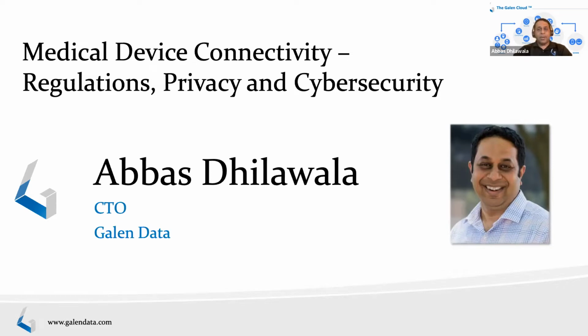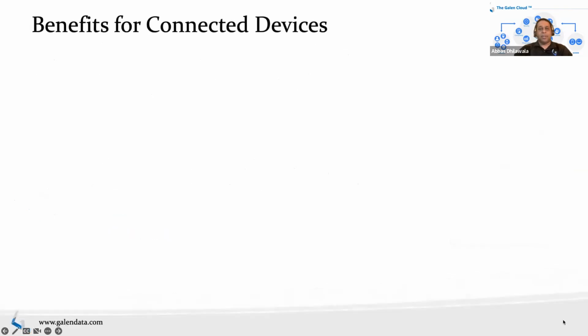So I want to start first by figuring out why do device connectivity, why connect the device? Some of the benefits are obvious, but I want to go through some of the important ones just as a general background. So think of some of the use cases such as remote monitoring, right? So remote monitoring has become essential in many settings. Think of telehealth. As of last year, roughly 10% of the visits were done through telehealth. In the heart of the pandemic, in early 2020, it was as high as 20%. So telehealth is slowly increasing. It did get a spike, has come back down, but it's still an upward trajectory.